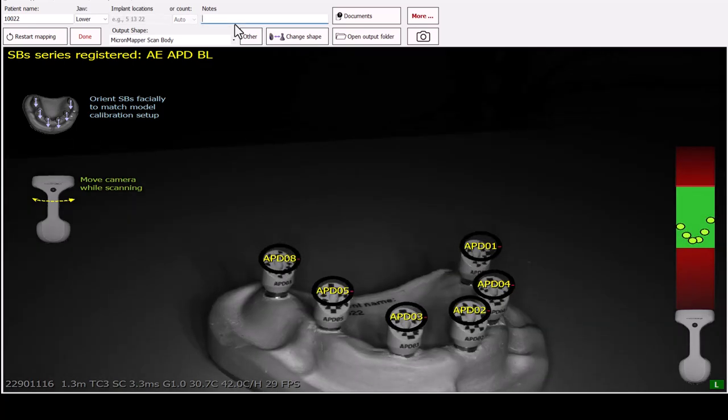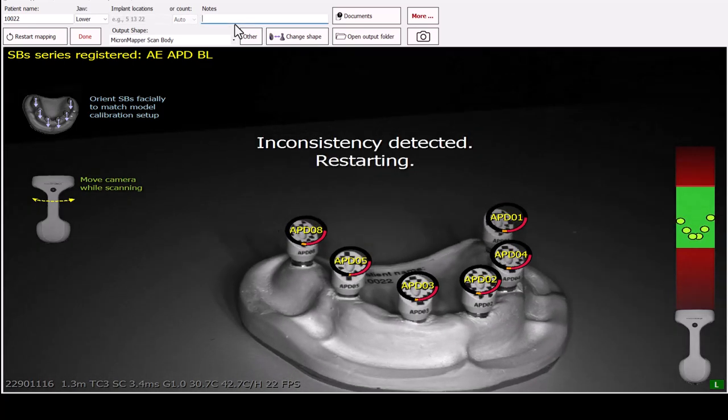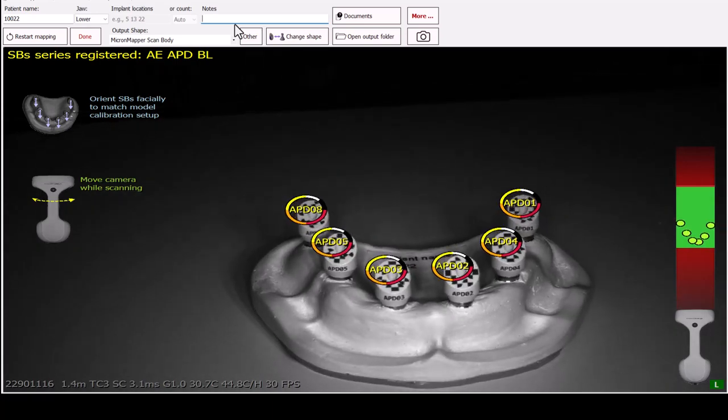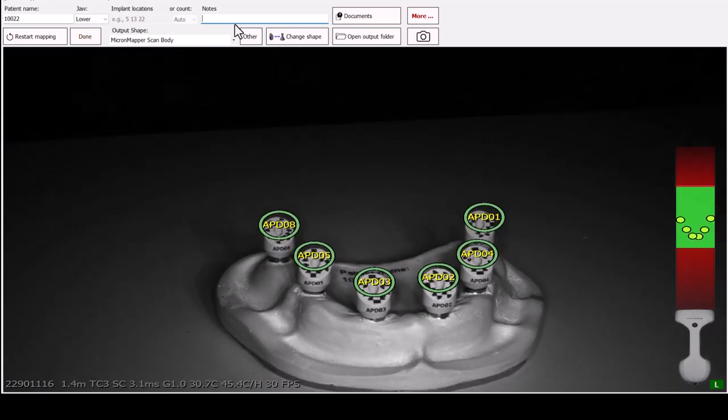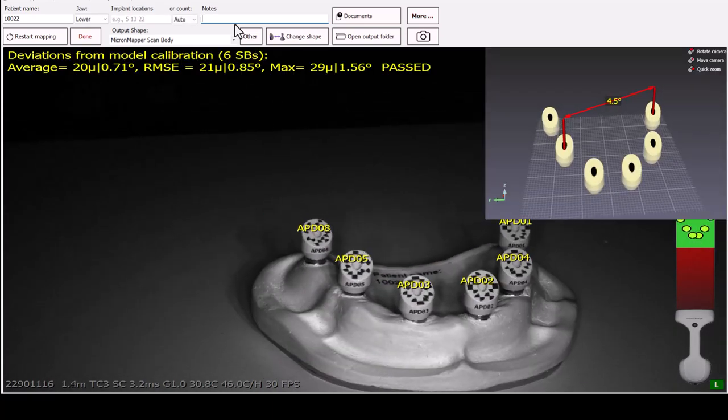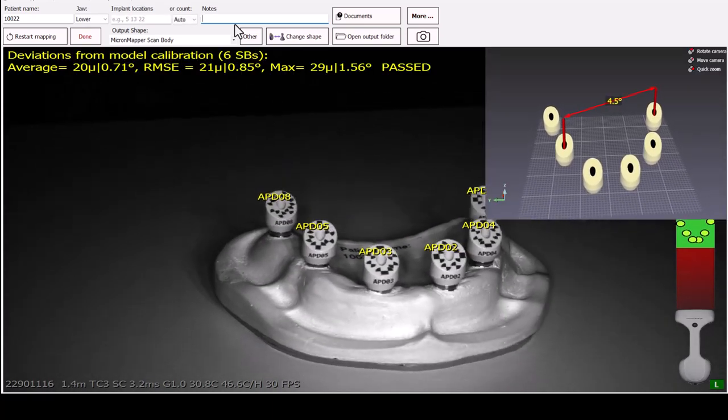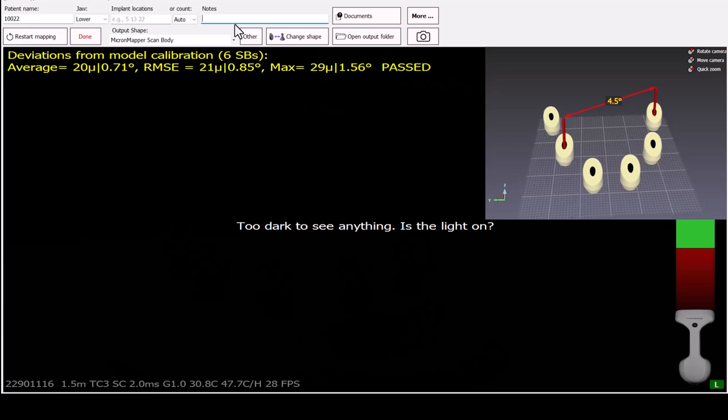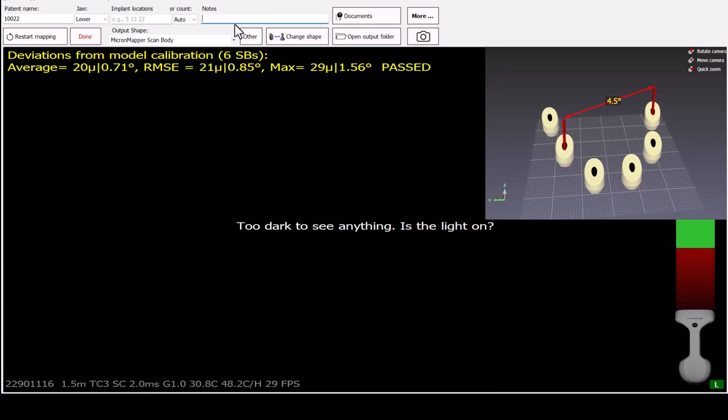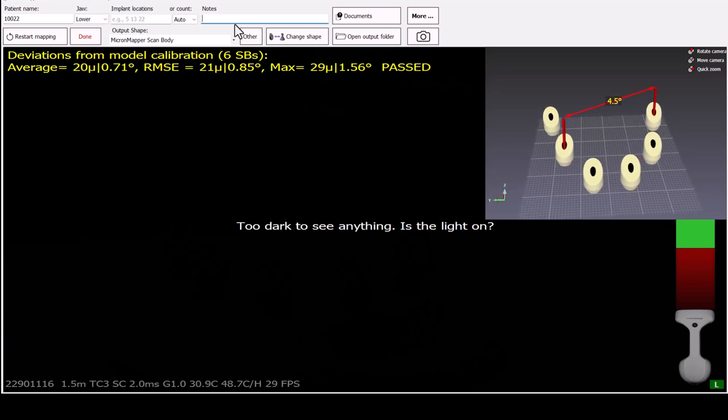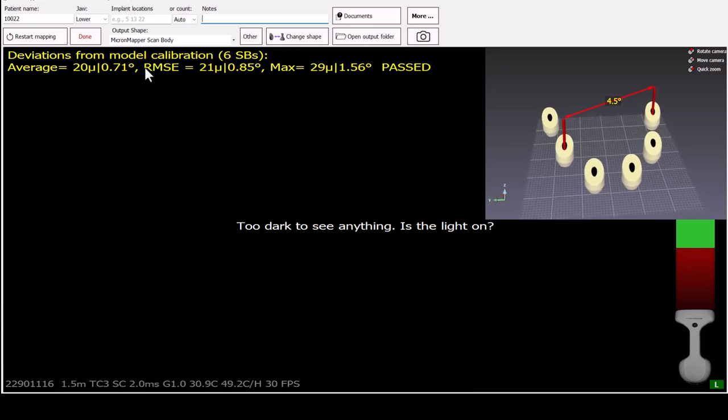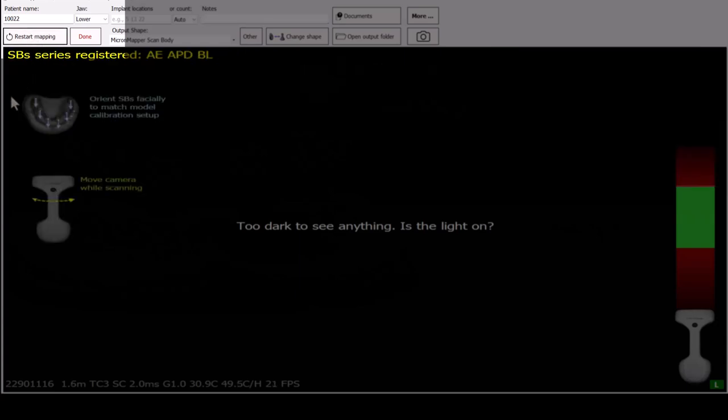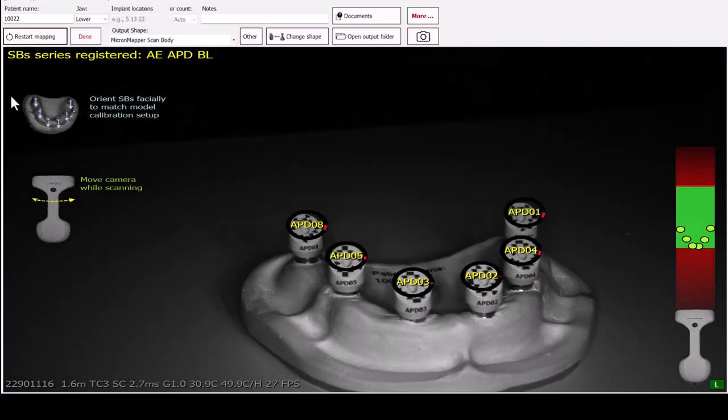Once mapping begins, please gently move the device from side to side in order to capture all the necessary data. You can see the progress by the circles above the scan bodies. Once finished, you can press Done or Restart Mapping by pressing the appropriate button.